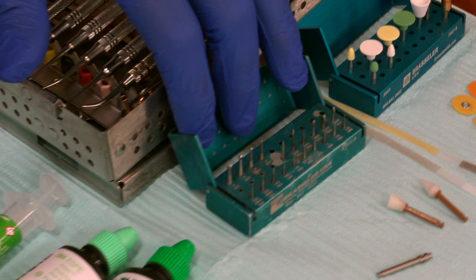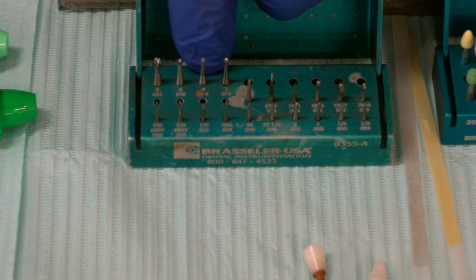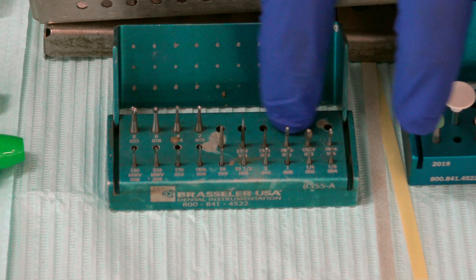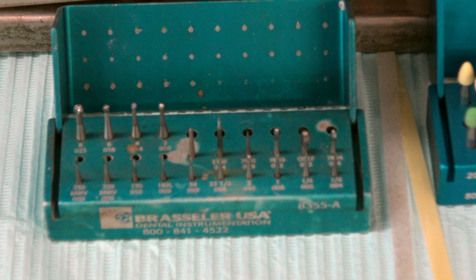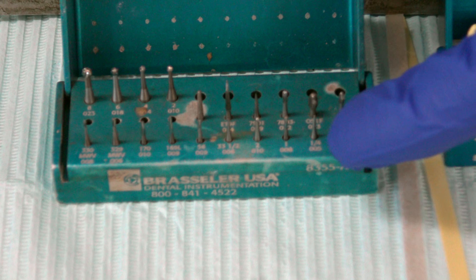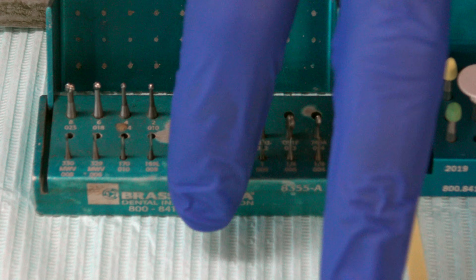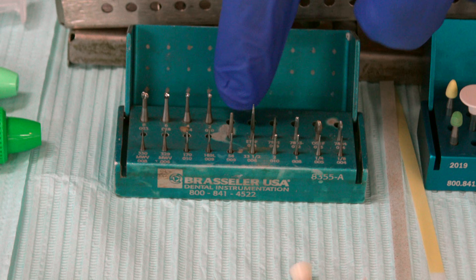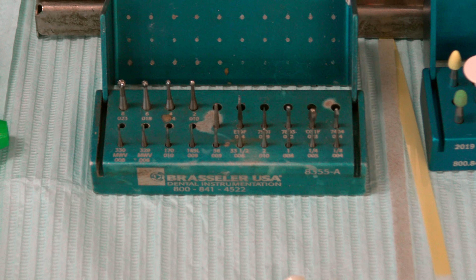Over here we have our carbide block, our operative block. They come with latch round burs that can excavate decay, finishing burs for finishing composite and removing sharp enamel, and then our carbides like our 329, 330s, and 56s, which are used to actually prep into the tooth. To keep it simple: prep, excavate decay, finish. I like the 7901 and the 7404, especially for finishing composites.